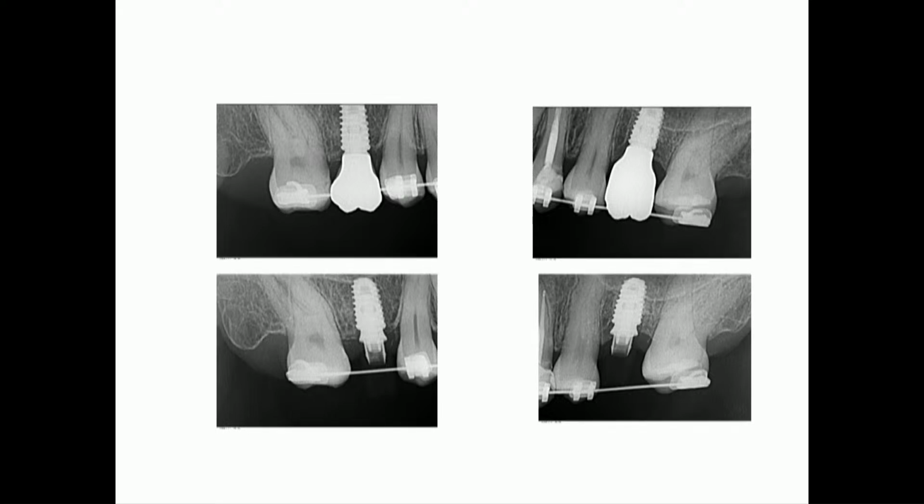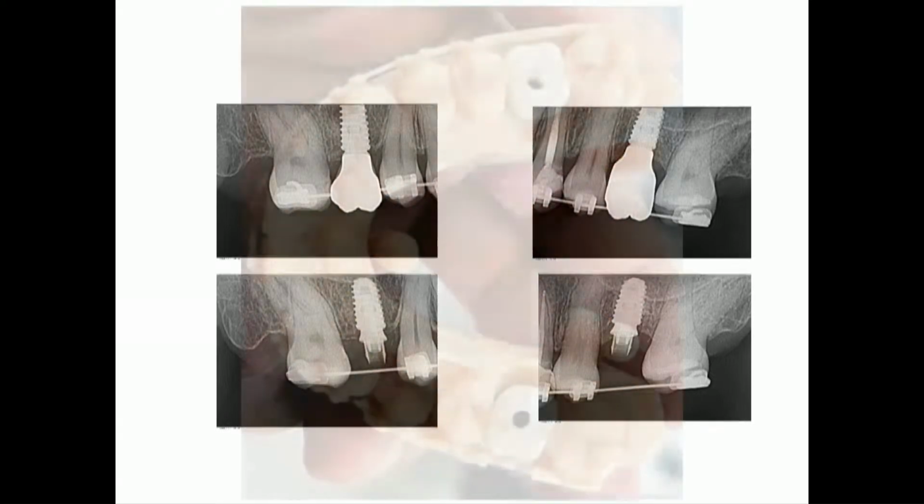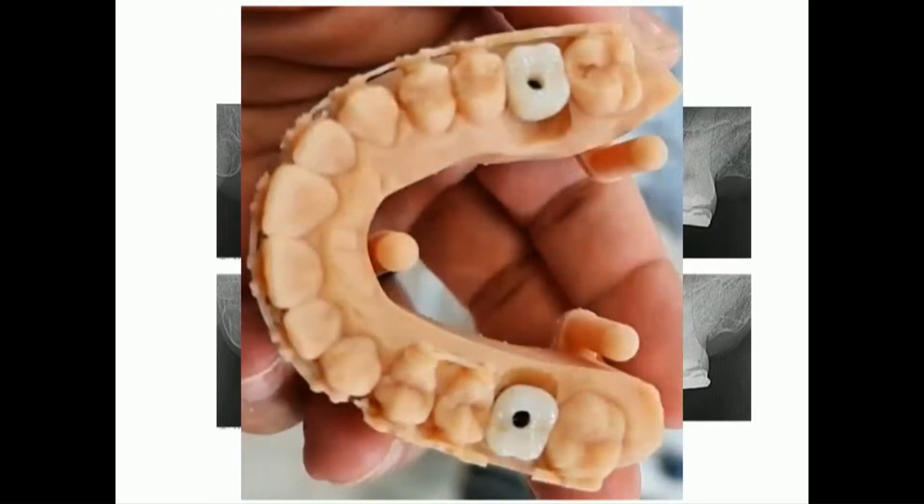So I did that, and then after that, delivered the crowns with ease, with the wires on. And you can even print the models with the wires on. You can't do this with regular analog dentistry. And that's why I love digital dentistry.